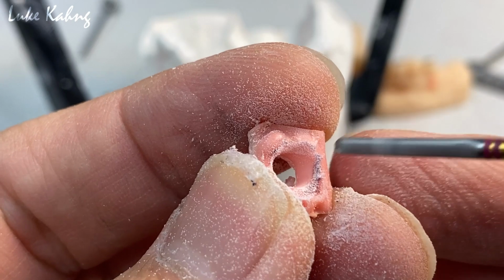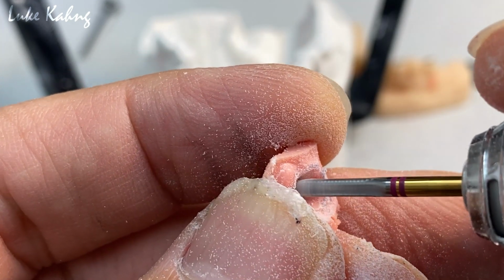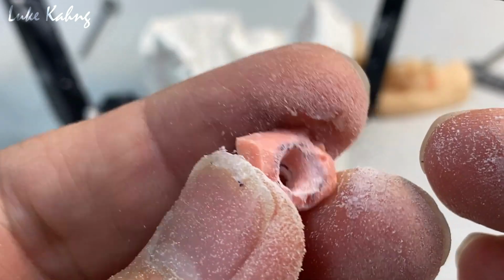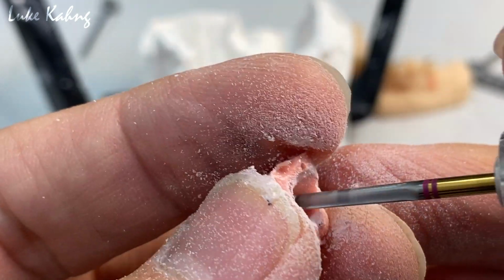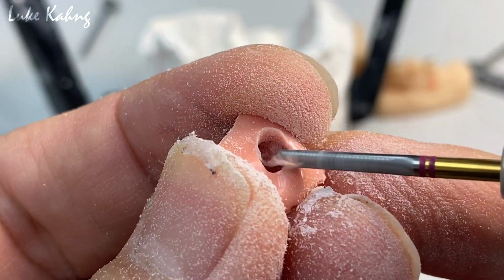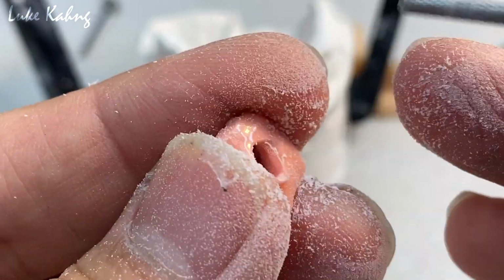I compare it to a house. In order to make the perfect house, we have to make a good strategy. Just like where's the kitchen, where's the bathroom, how many bedrooms, where's the garage, like that. So that's enough, we can cut it, so the doctor can reduce it and then preserve it with their tissue to make the best full mouth implant, either zirconia or hybrid case.